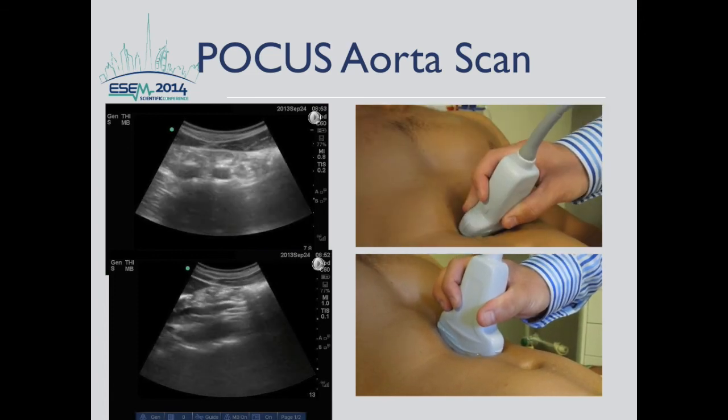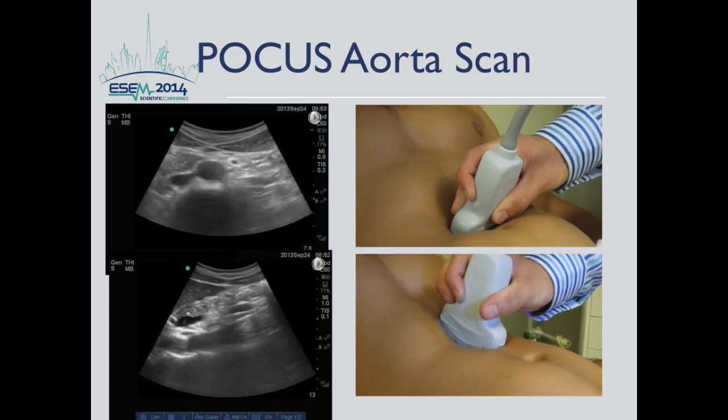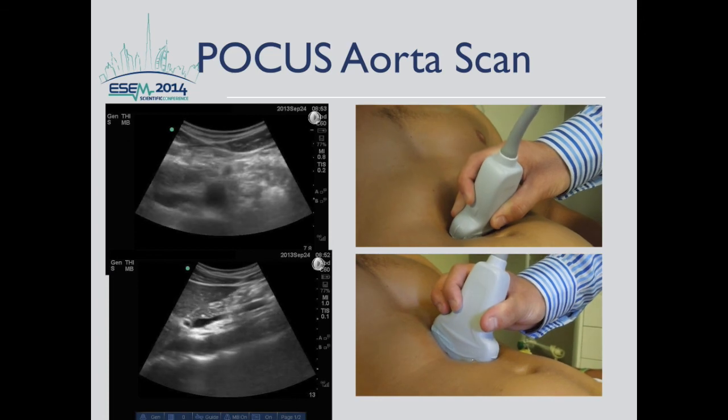This study can save lives and can make a big difference in the patient's care in the emergency department. So go and learn and scan some aortas.